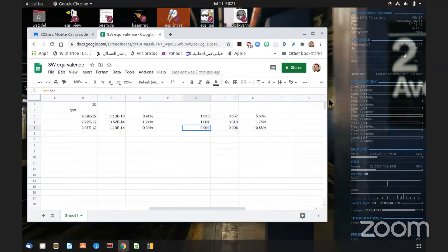Okay. No, your field is 10 by 10, and you are not isocentric. You are 5 off center. No, but off center by how much? Let's say 5 centimeters. But 5 centimeters will be at the edge of the field, right? Yes, yes. That is even worse, because now you're in the penumbra region. I don't know.